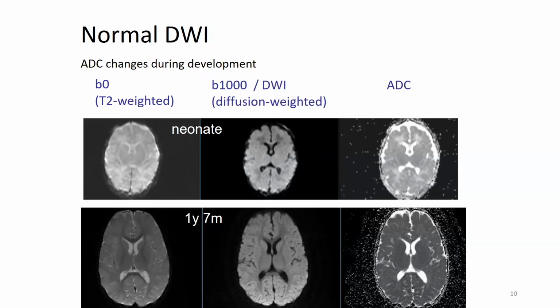No, indeed. It's not T1 weighted, not T2 weighted. It's just a measure of actually kind of the ratio between the B0 and the B1000. So then one small question, what's the difference between B0, a small b, and the capital B0?